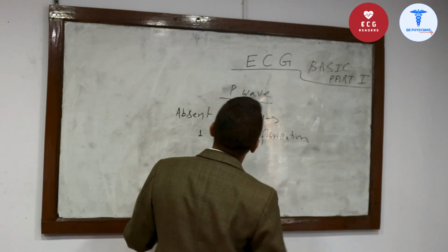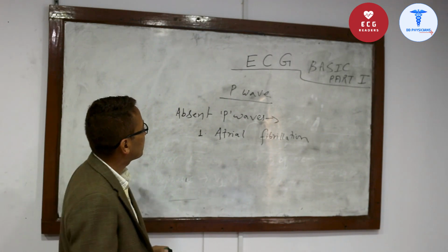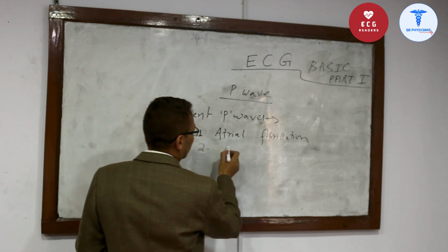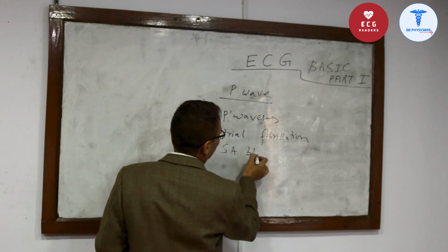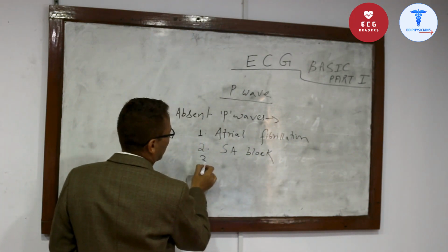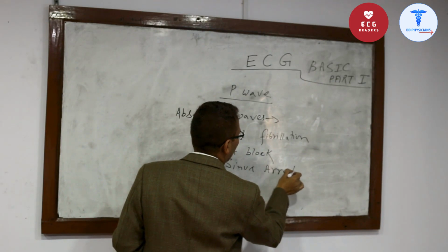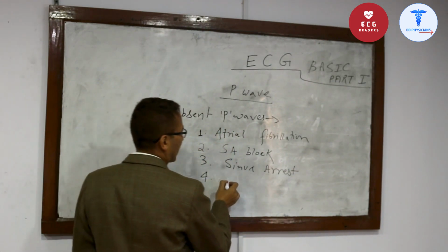The P wave may be absent in atrial fibrillation, in sinoatrial block, in sinus arrest, and in hyperkalemia.